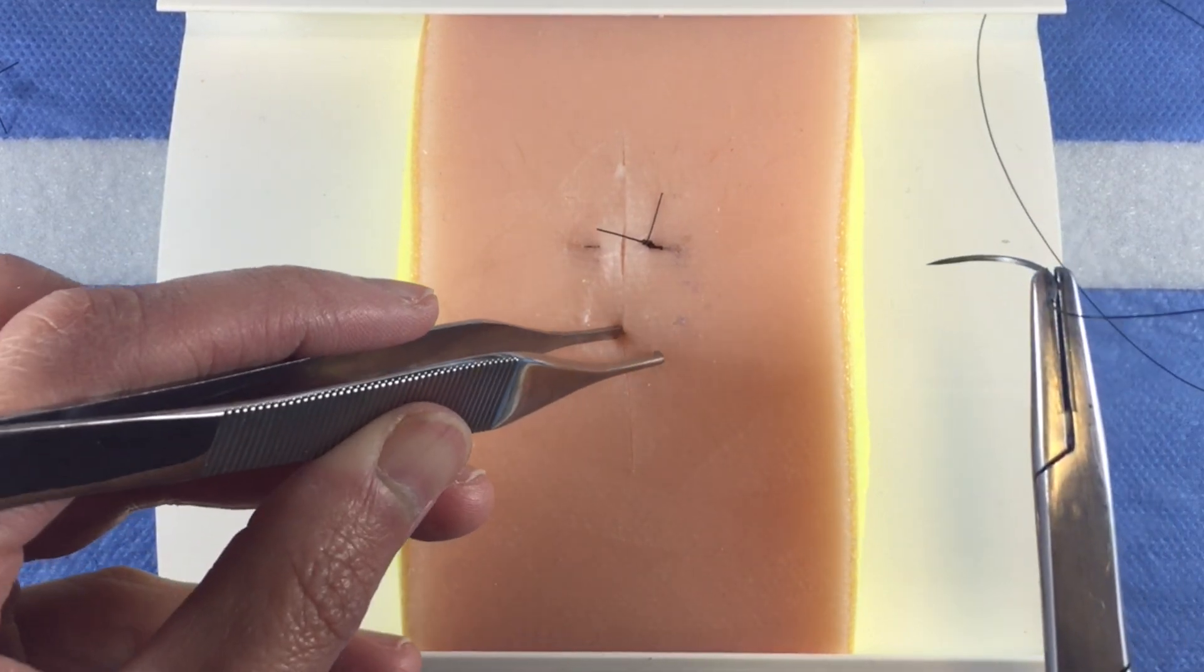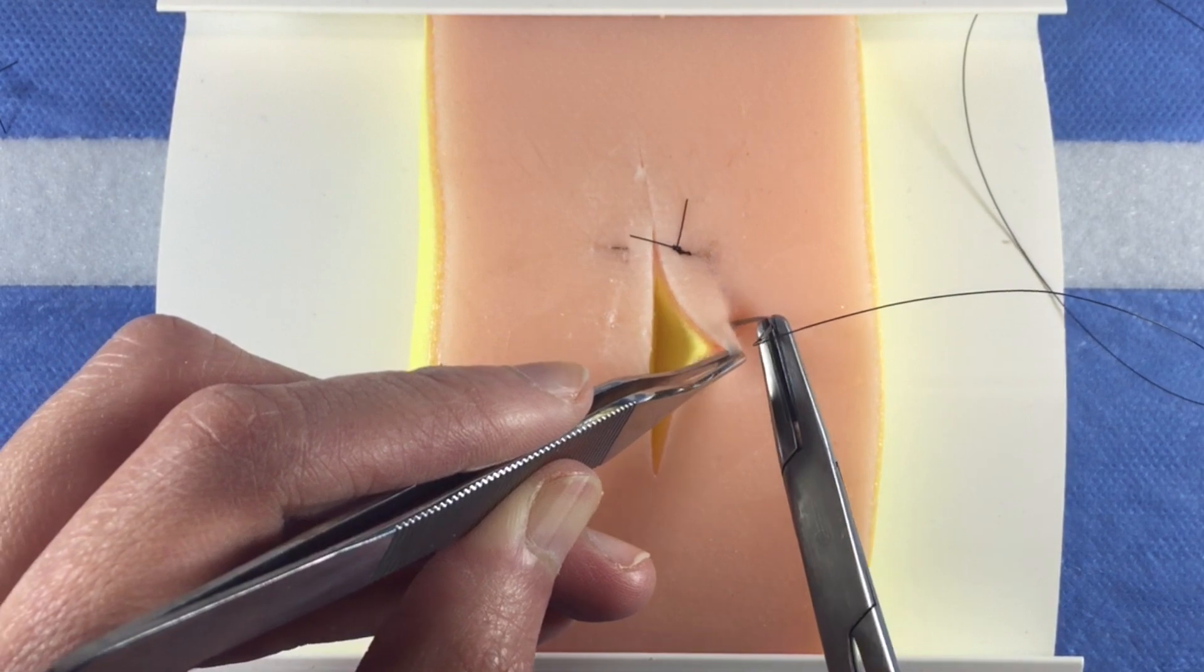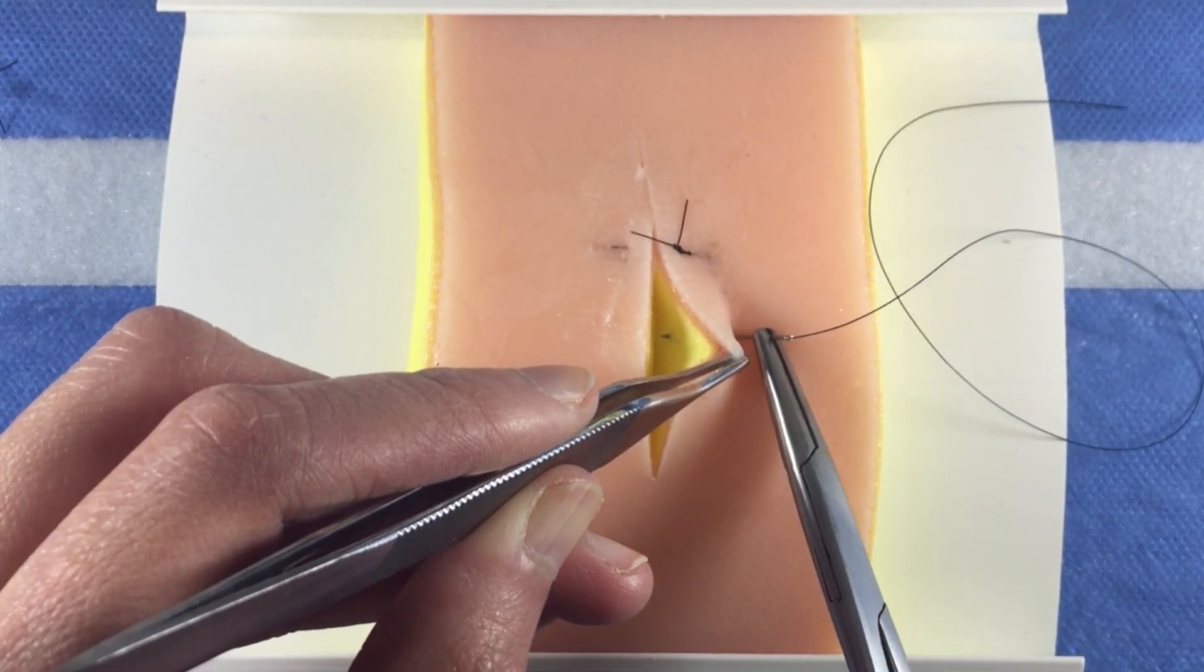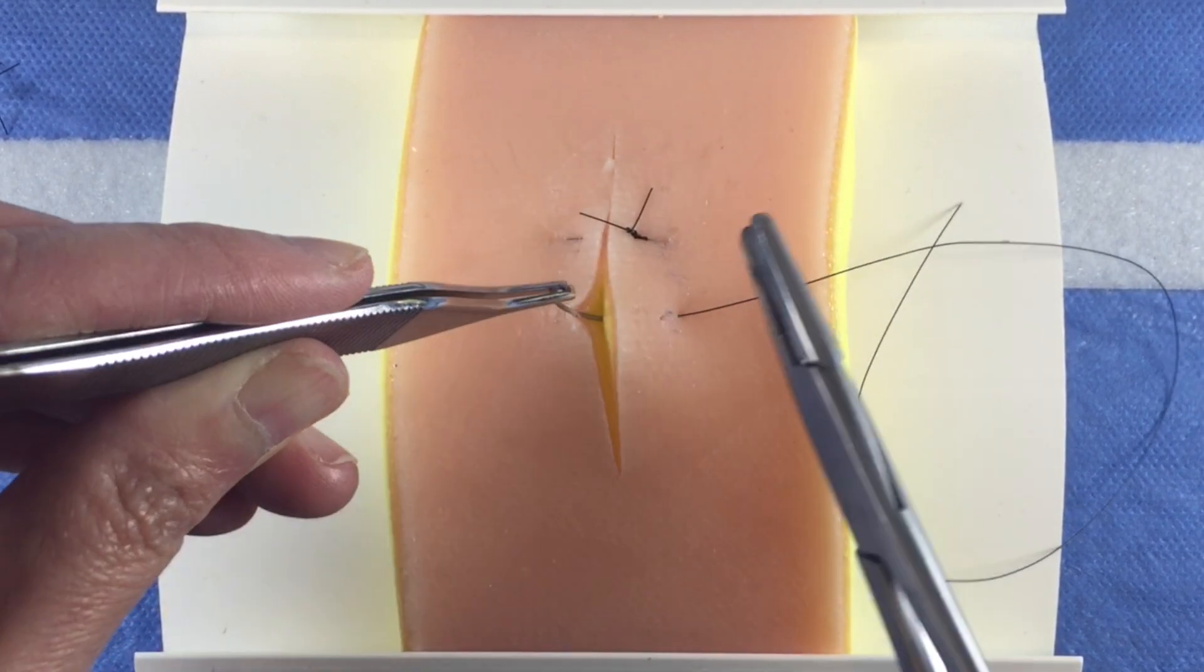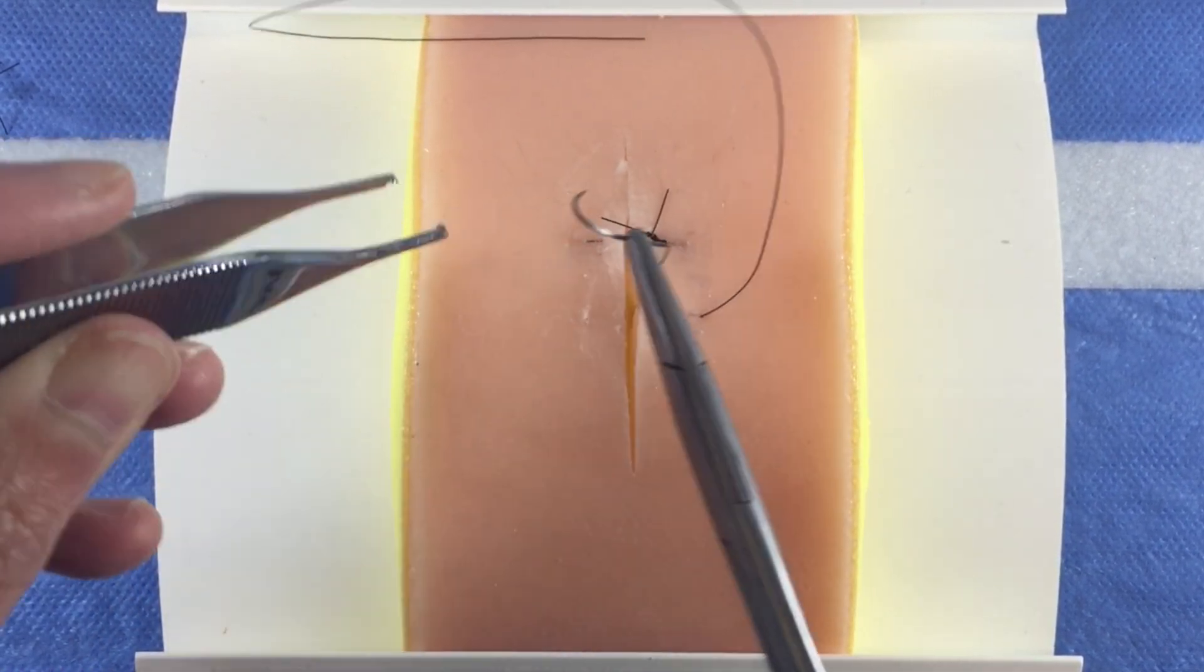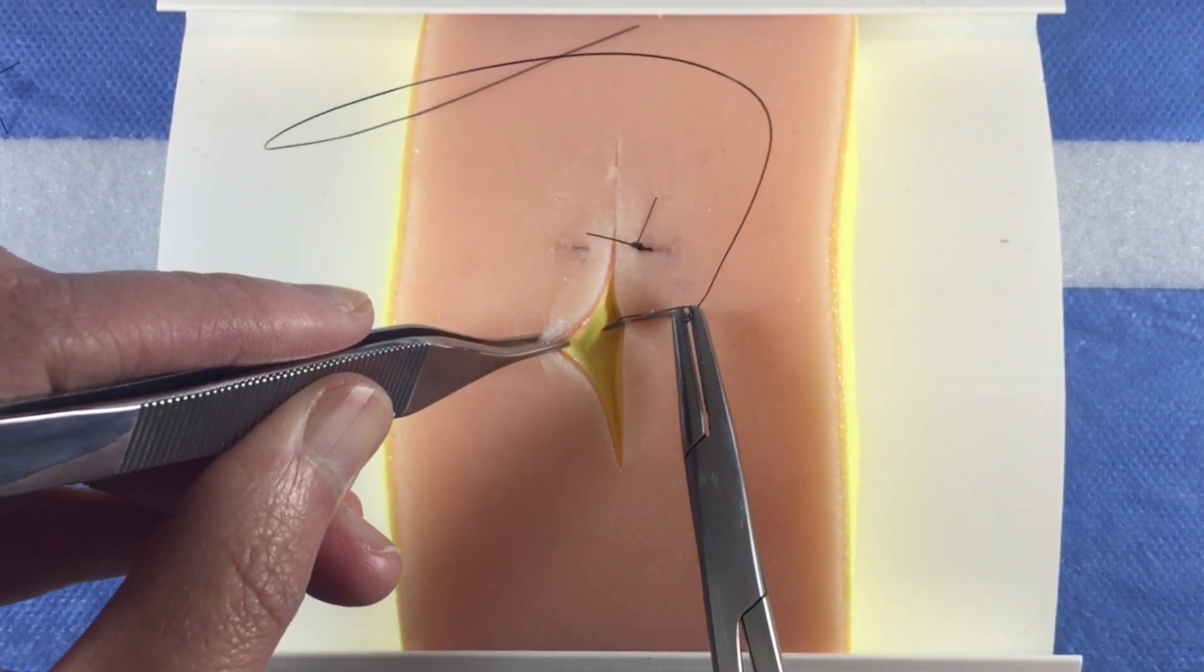To perform a vertical mattress stitch, start a distance away from the wound edge on one side. Place a deep bite. It may be best to take the bite in two steps, that is grab and reload the needle halfway through and use a separate bite to come through the opposite side.